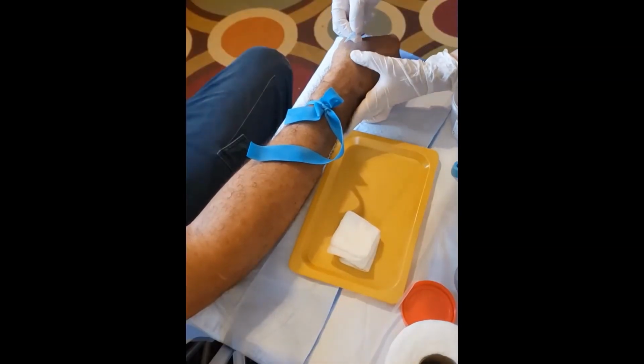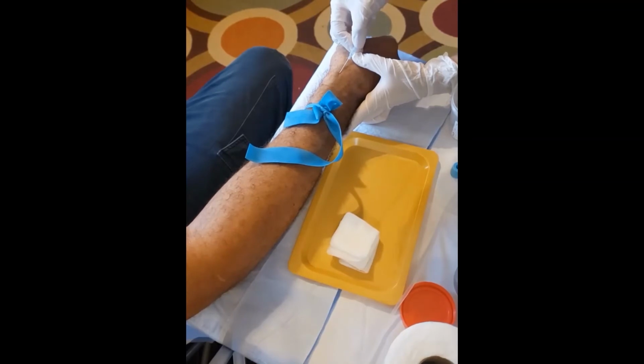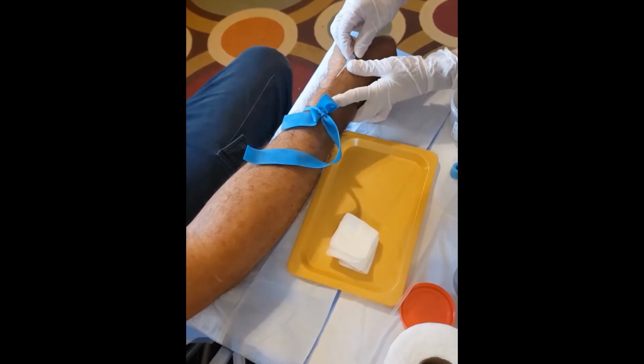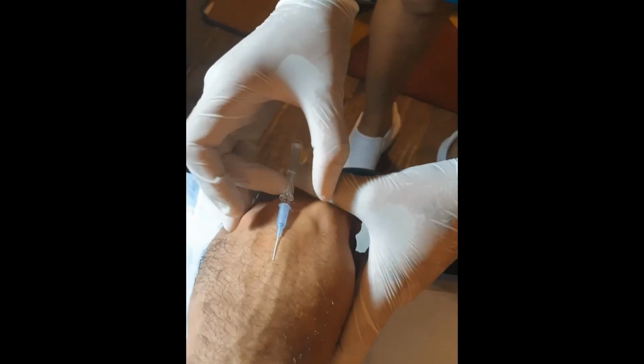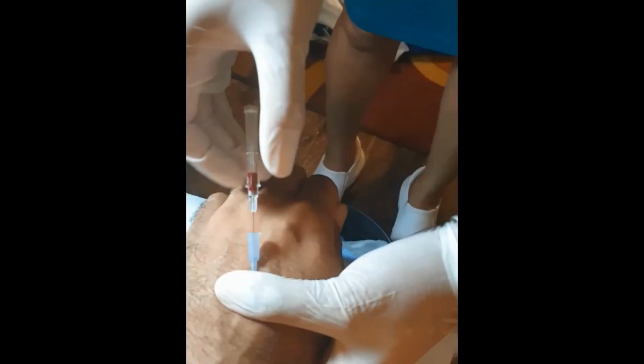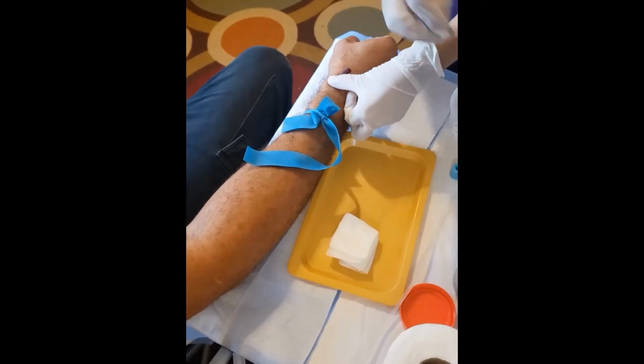Hold the catheter at a 15 to 30 degree angle and insert the catheter through the skin and into the vein. When the flash is achieved, the cannula is advanced while holding the needle in place, preventing further damage to skin tissues, which could lead to a rupture in the vein as the needle cuts through the vein further. After the entire cannula is in the skin and the male end of the luer lock is all that can be seen, the introducer needle is completely withdrawn.